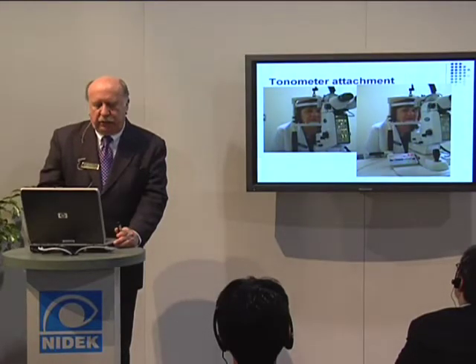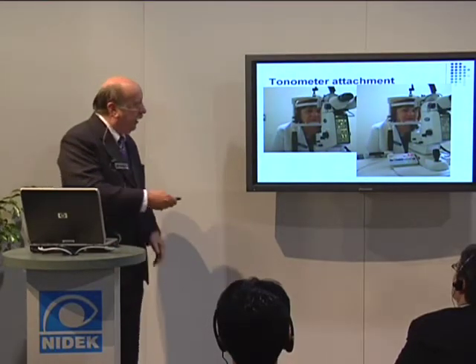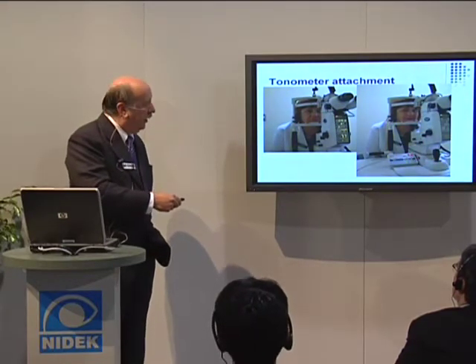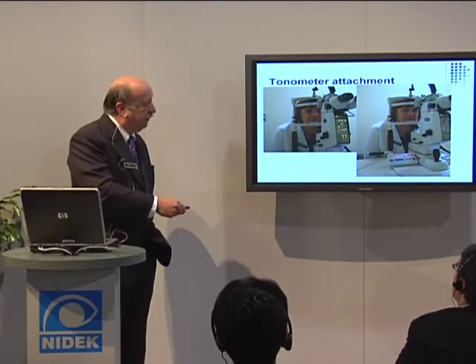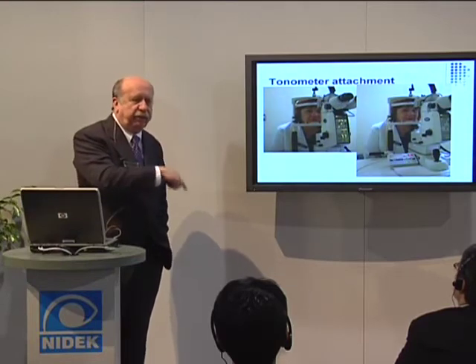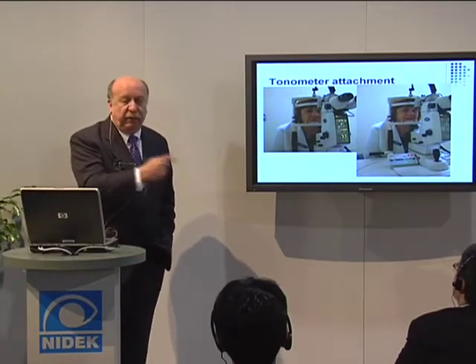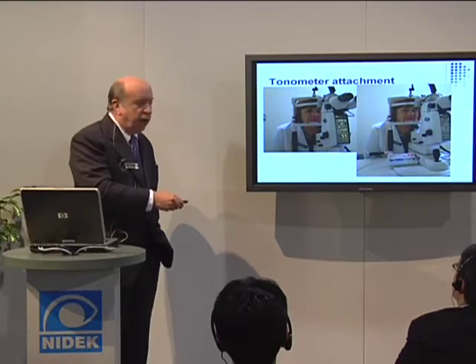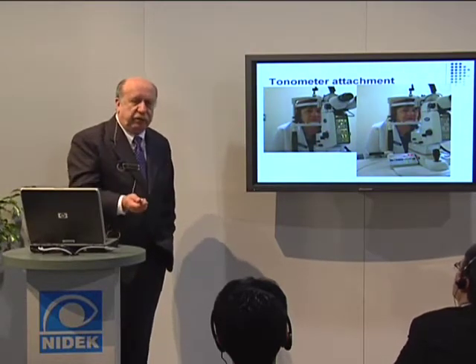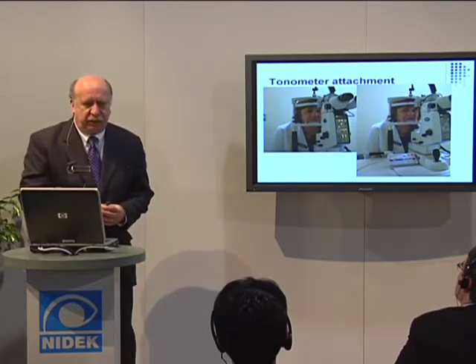So you can see all the controls here on the Nidek are located right in the YAG portion, or right in front of the treating physician. Also, the control box for the 532 is located here. The actual switch is located on the combination adapter on top, where it's just a lever that goes from one type of wavelength to the other, and it actually turns on both systems when you do that. So it turns off the system that you've left and turns on the system that you're going to, so it recognizes that.